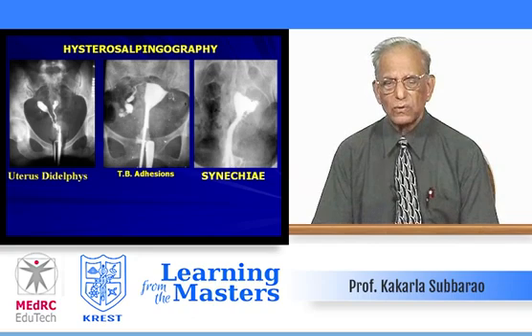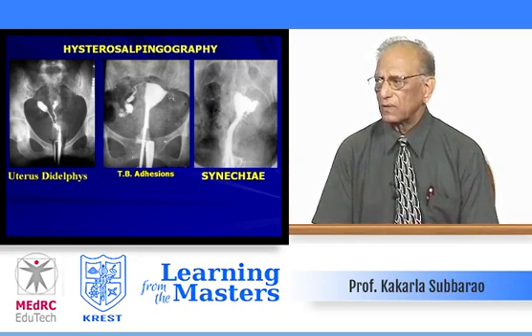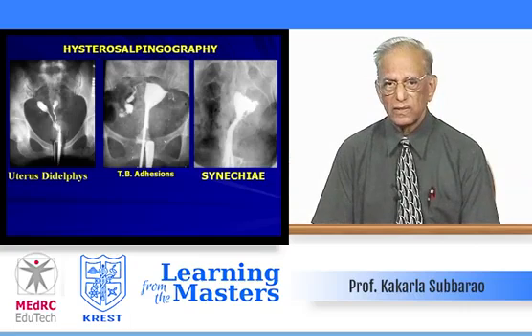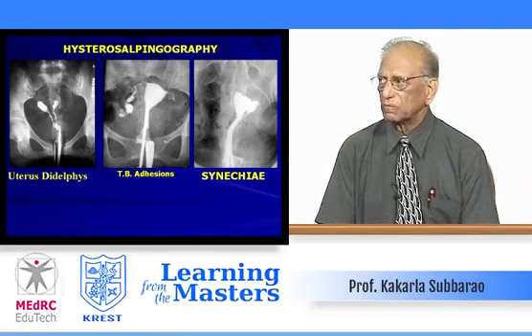Hysterosalpingography, even today we do certain times, and congenital abnormalities like uterine didelphys, TB adhesions of the tubes, and synechiae after curettage. All these can be demonstrated with hysterosalpingography.